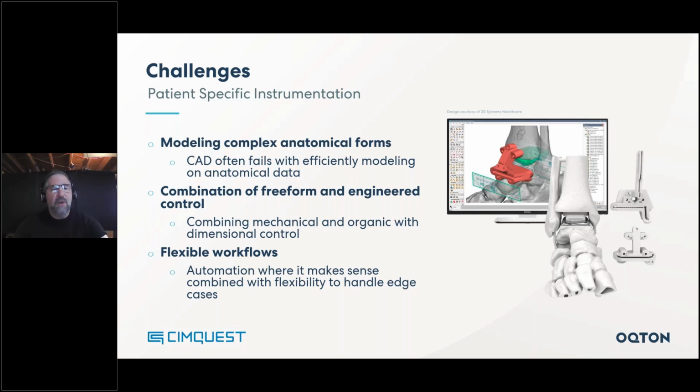You read something off of a patient sheet, you put one wrong letter or one wrong number, send it down through your pipeline to be manufactured. It doesn't get noticed till after the part has actually been produced. The quality system picks it up, and that triggers an entire rebuild. Something like that is catastrophic. So having some automated assistance will allow you to hopefully avoid some of those cases.